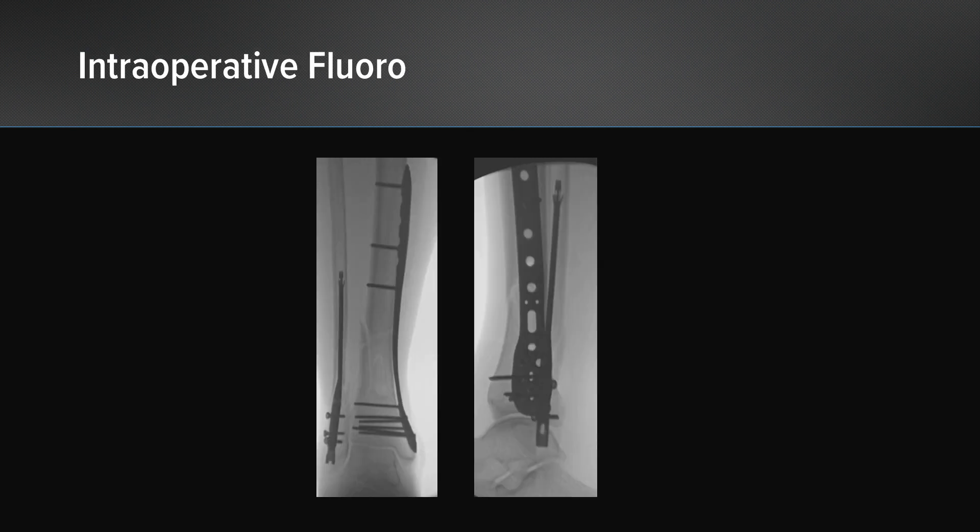These are our intraoperative fluoroscopy images. They demonstrate the application of the medial distal tibial plate and show the insertion of the Fibuloc Nail. This construct allows us to resist the valgus forces that would tend to create a failure scenario if the plate was used alone.